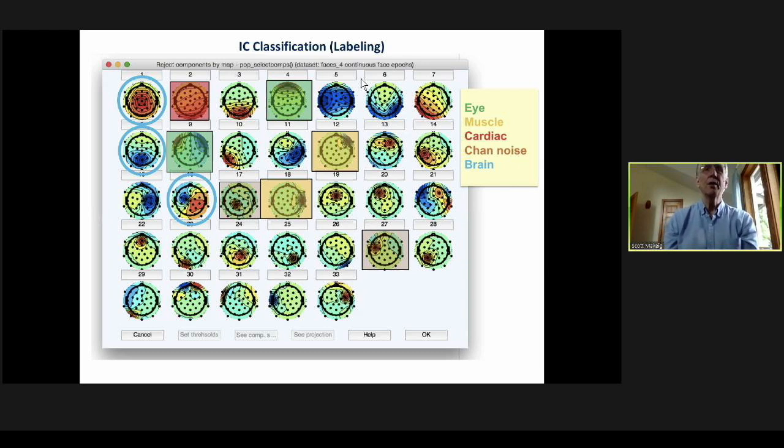Well, okay. What I forgot was, or what we forgot was that we had years to develop that ability, not only by looking at the scalp maps, but also looking at the activity profiles, the spectra, and so on.